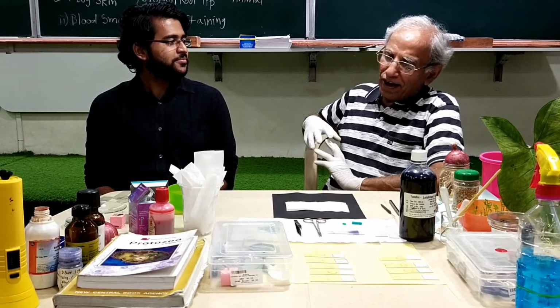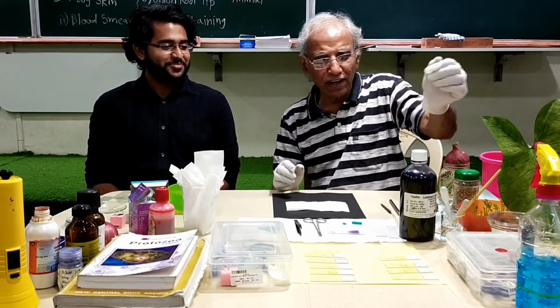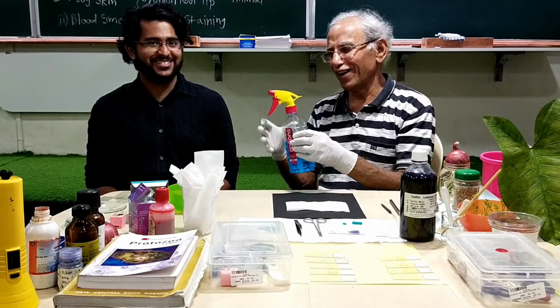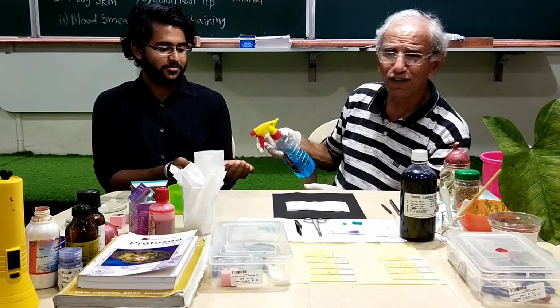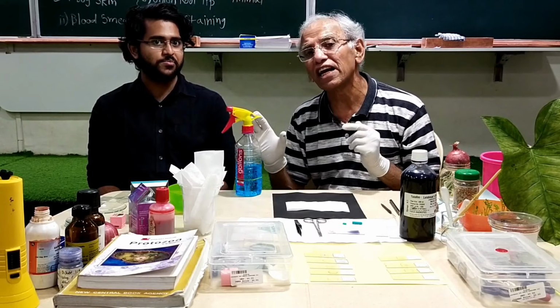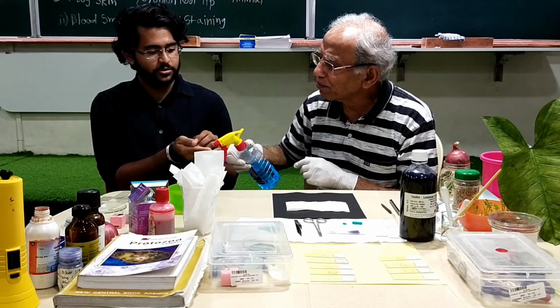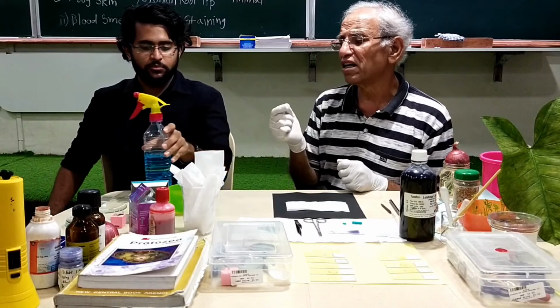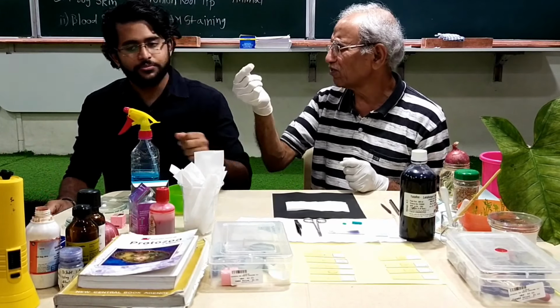And are you afraid of blood? I'm not afraid of it. Okay. So I think we'll proceed. I think this is our regular sanitizer, alcohol, whatever is available. I think, okay, as usual. This is very important these days. Otherwise also, you have to definitely sterilize your finger. So you can have a, yeah, please do it, yes. I think we need a cotton swab also. Can you just get it? Yes. A tissue or cotton swab.